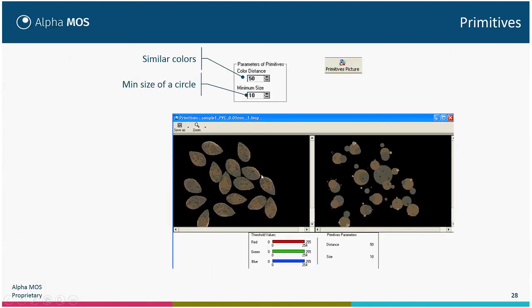Primitives allow determination of the proportion of a specific color in one object. This is shown on the raw image after removal of the background. The primitive determines the equivalent area of one specific color. The size of the circle is proportional to the average area of that color, and this can give an idea of the heterogeneity of colors in the image.